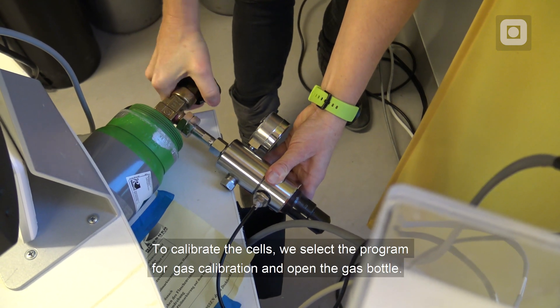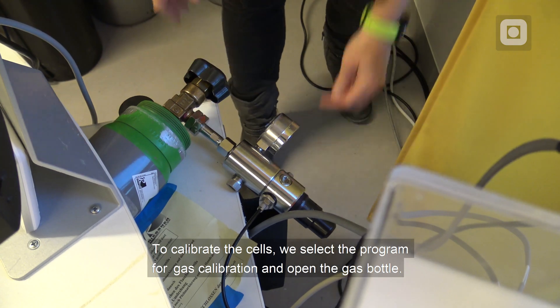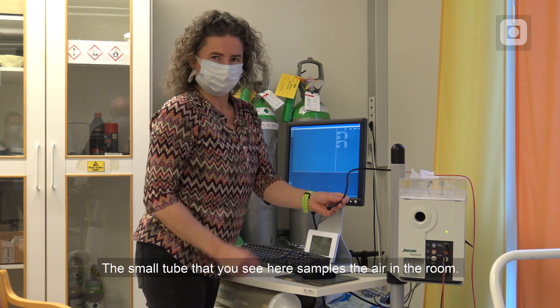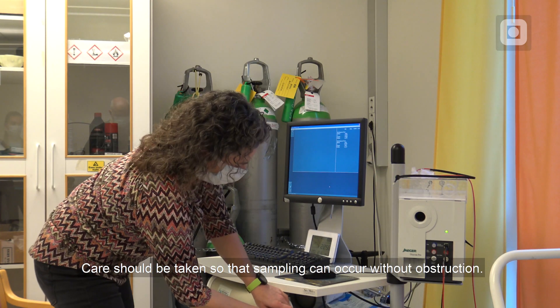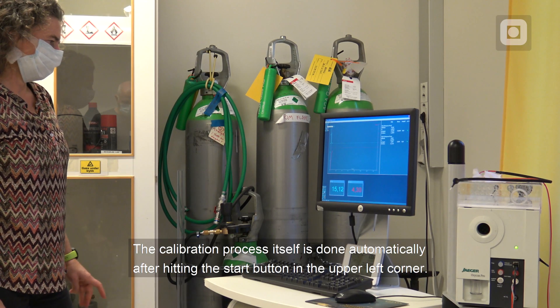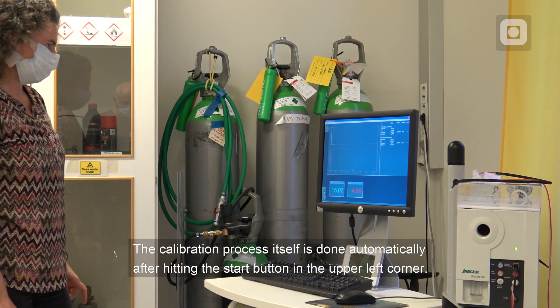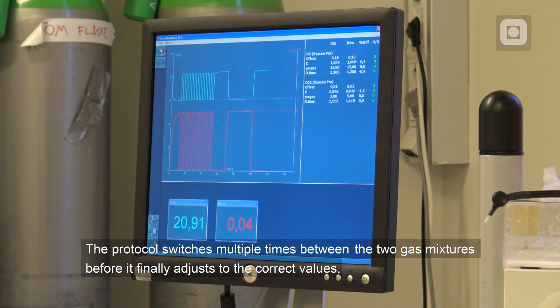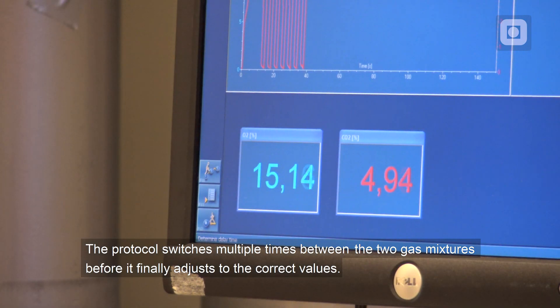To calibrate the cells, we select the program for gas calibration and open the gas bottle. The small tube that you see here samples the air in the room, and care should be taken so that sampling can occur without obstruction. The calibration process itself is done automatically after hitting the start button in the upper left corner. The protocol switches multiple times between the two gas mixtures before it finally adjusts to the correct values.